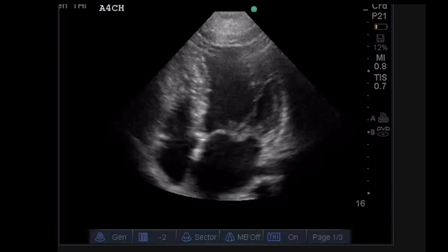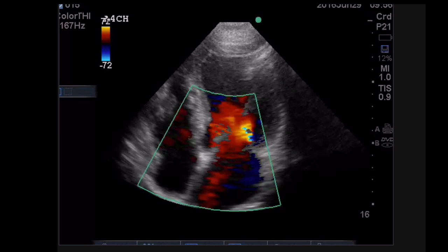You can see those two leaflets aren't co-apting — they're missing each other. She has a flail segment. Here's the septal portion, and if you put color flow on this, she has a huge regurgitation jet and her valves aren't lining up at all. This goes into the next level — I need to know more about valves — but the basics can give you a sense of when to start investigating valves.